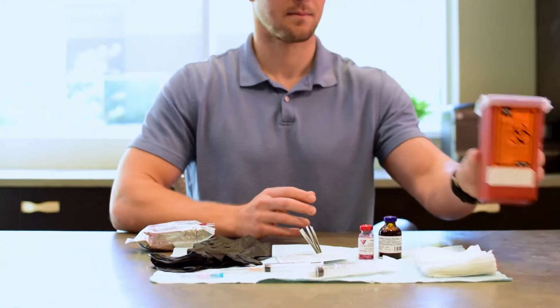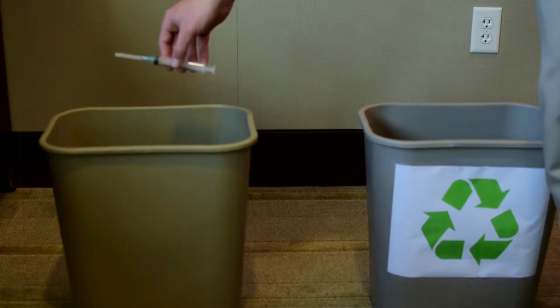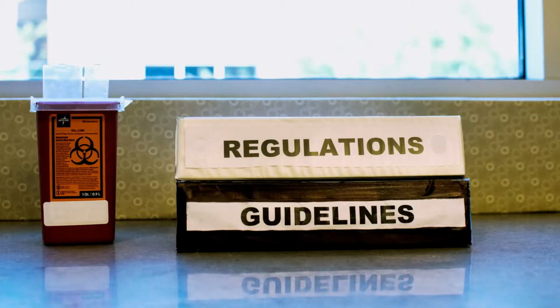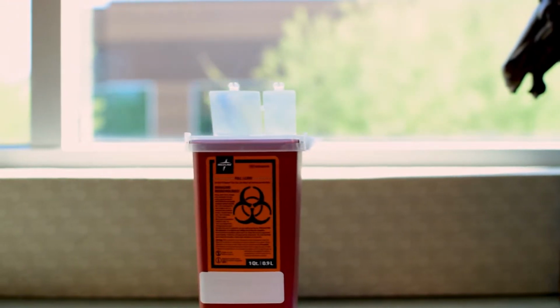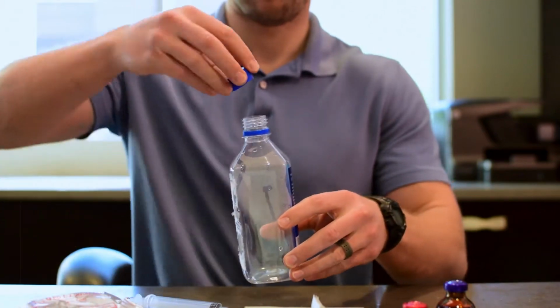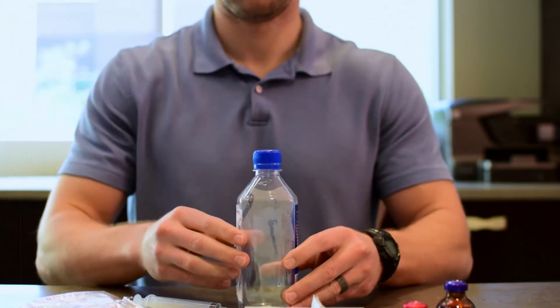It is important to dispose of your syringes and needles correctly. Needles and syringes should not be thrown in general trash, are not recyclable, and are subject to state laws regarding proper disposal. You may receive or need to purchase a hard plastic container made specifically for used syringes and needles. In a pinch, you can use a soda bottle or some other plastic bottle with a screw-top lid.